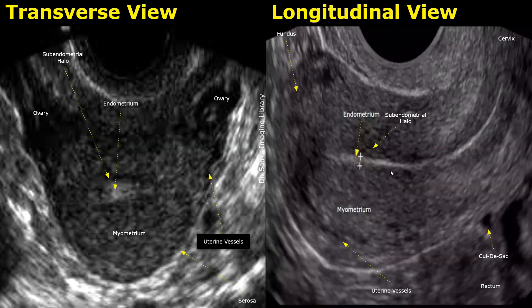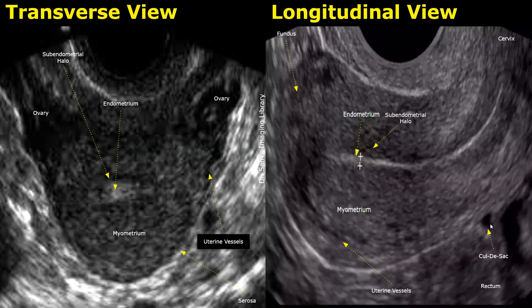The image on the right shows the uterus in the longitudinal plane. The endometrium is seen more clearly in this image. The subendometrial zone is also visible. This is the fundus, and this is the cervix. These are the uterine vessels — tubular and small round anechoic structures. This is the rectum, posterior to the uterus. This is the cul-de-sac, also known as the pouch of Douglas or the recto-uterine pouch. It is the most dependent portion of the female pelvis, located between the posterior wall of the uterus and the anterior wall of the rectum.